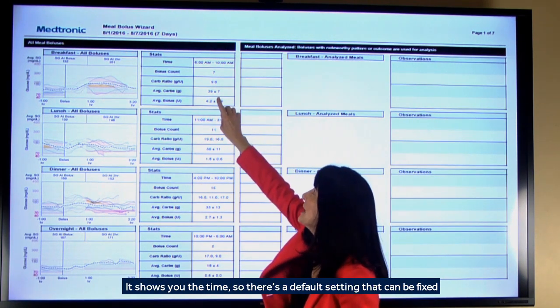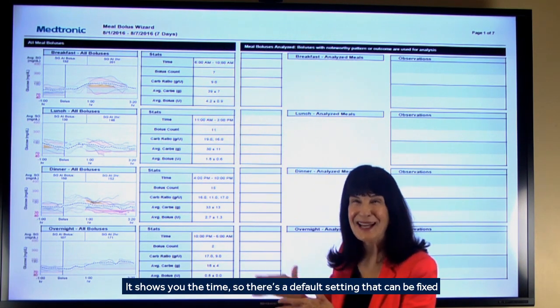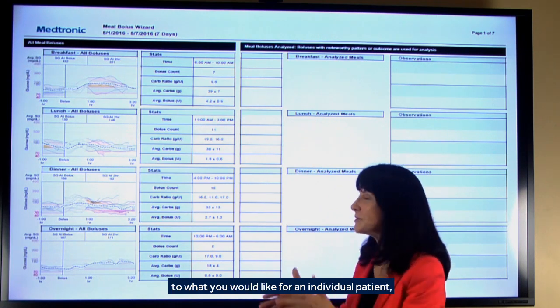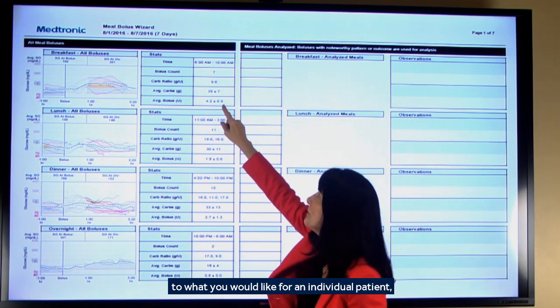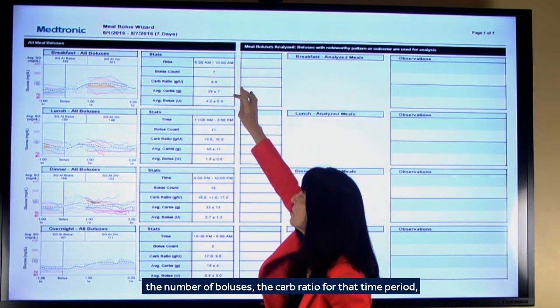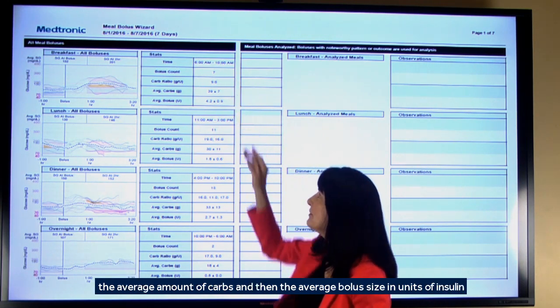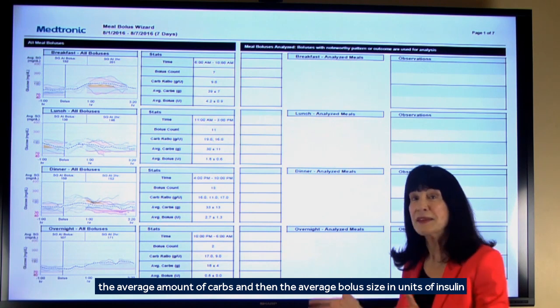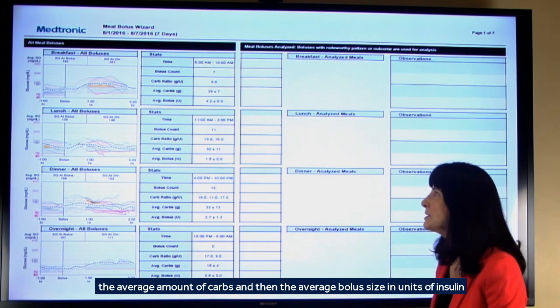It shows you the time, so there's a default setting that can be fixed to what you would like for an individual patient, the number of boluses, the carb ratio for that time period, the average amount of carbs, and then the average bolus size in units of insulin.